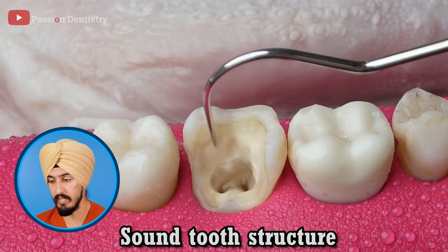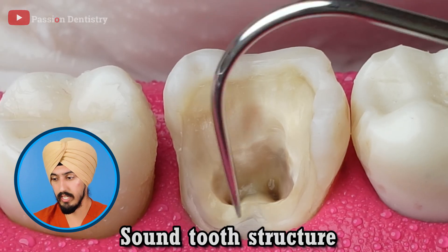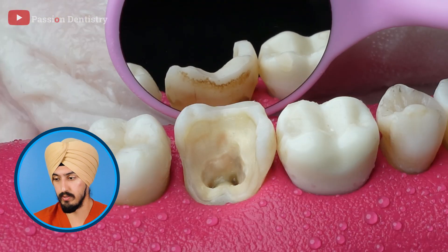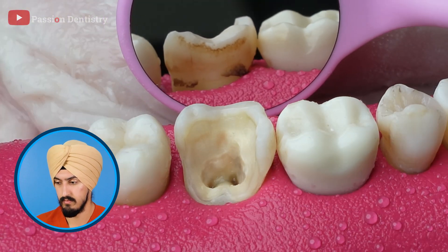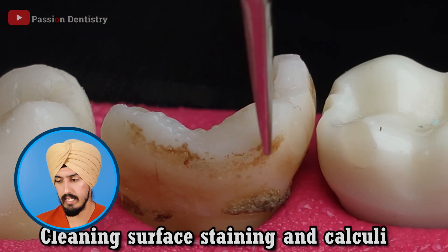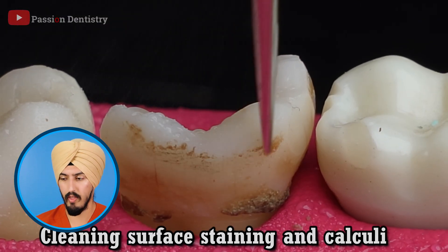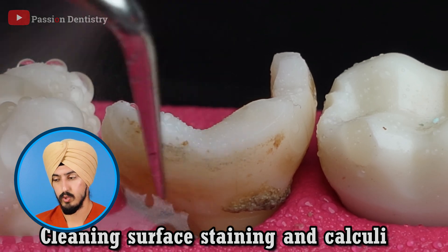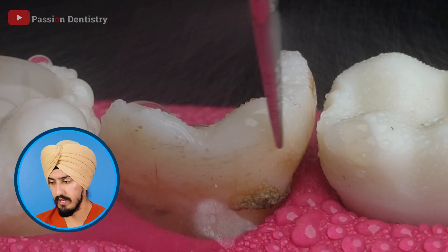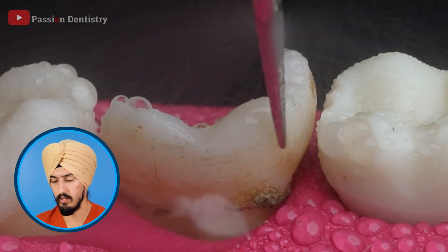So now everything looks really sound and really clean — you can see that clean-looking tooth structure. That's kind of what it looks like when you do an actual root canal on a real tooth. Fast forward a little bit — now he's just cleaning the tartar and stuff off the other side of the tooth, kind of doing a two-for-one. It's good to clean that away, but I'm going to fast forward to skip this part. He's just basically making it look really clean.